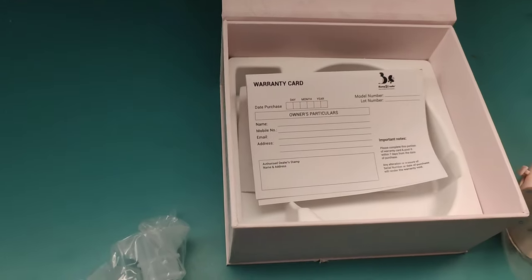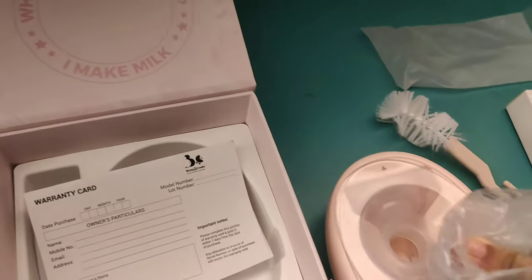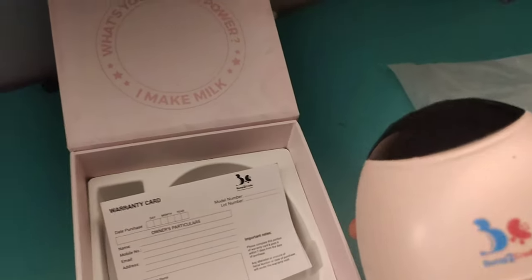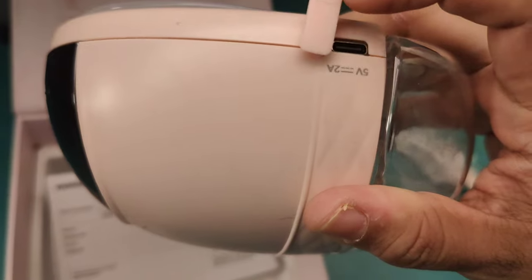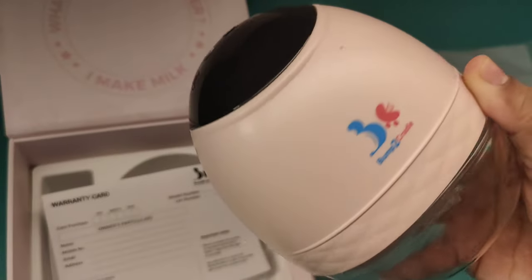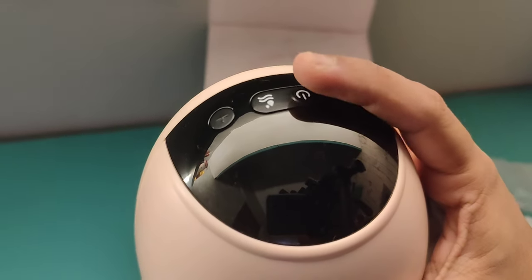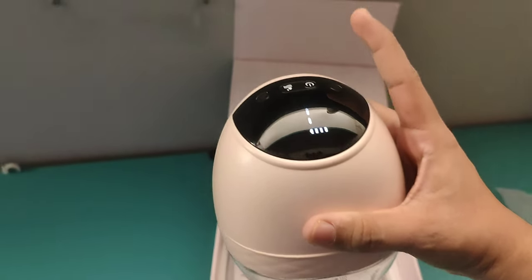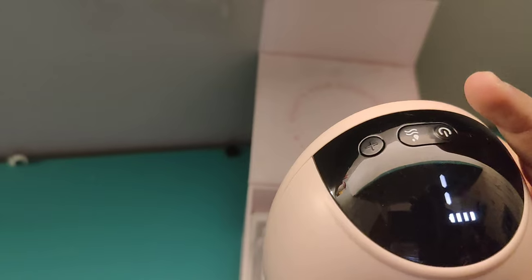There are some extra tubes that we can insert according to your size. Now I will tell you how to use it. First, charge it at the charging point for at least half an hour before using — it should be fully charged. When it is full, there will be 4 dots on the display.